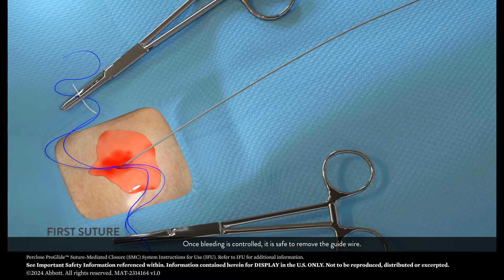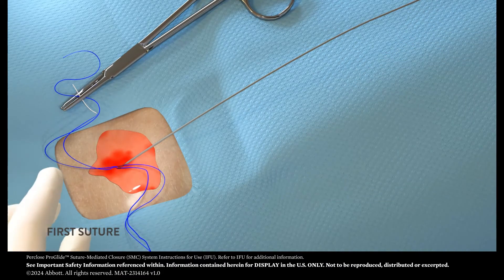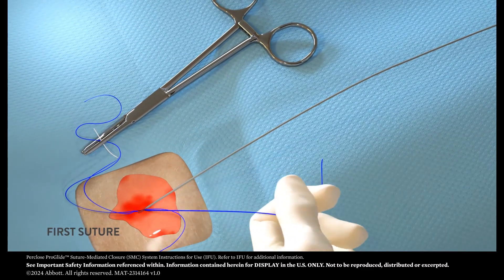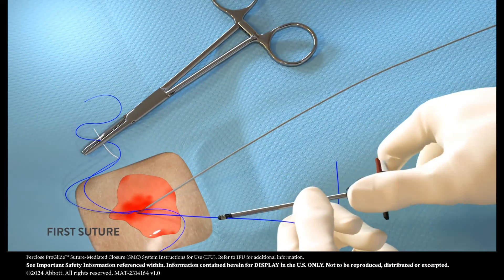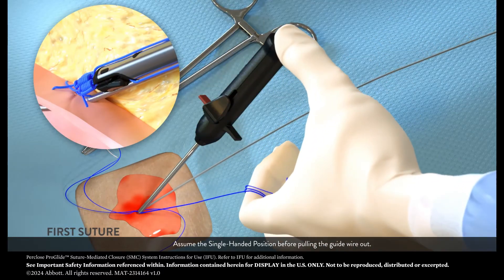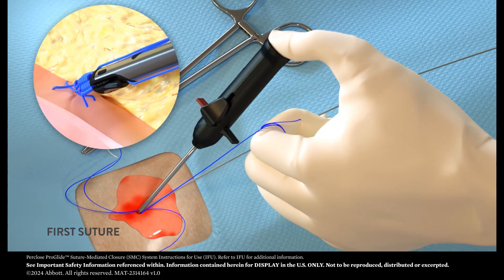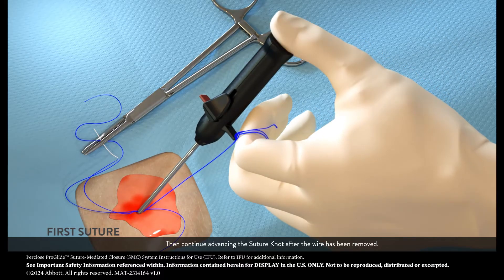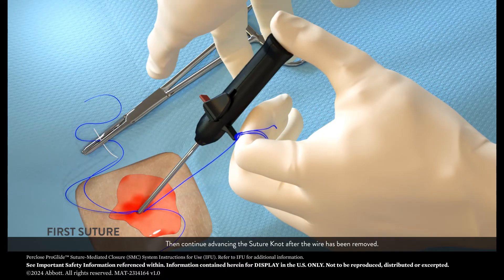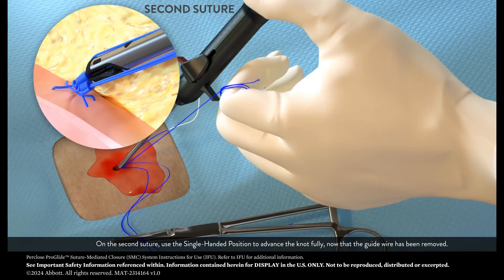Once bleeding is controlled, it is safe to remove the guide wire. Assume the single-handed position before pulling the guide wire out. Then continue advancing the suture knot after the wire has been removed. On the second suture, use the single-handed position to advance the knot fully now that the guide wire has been removed.